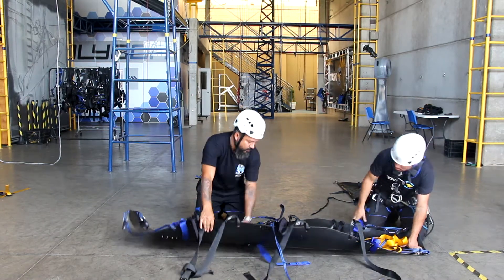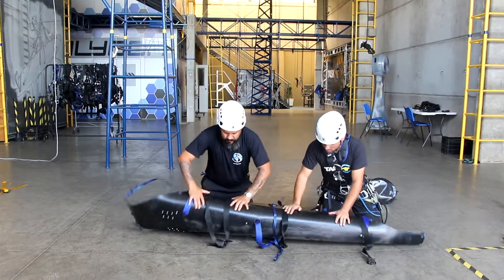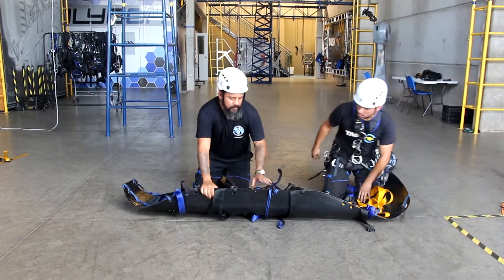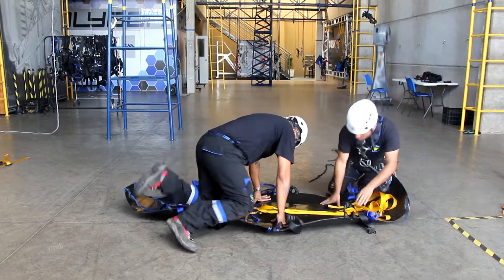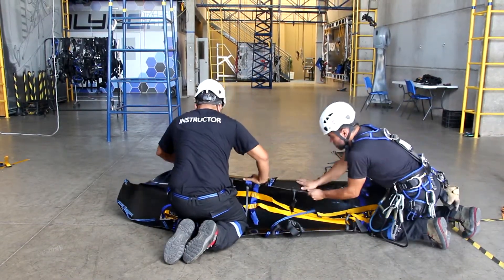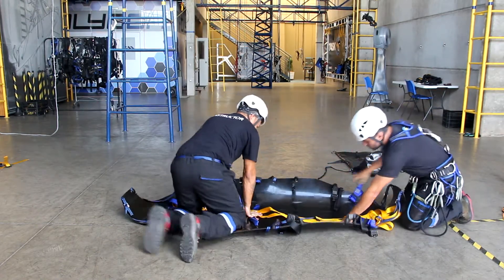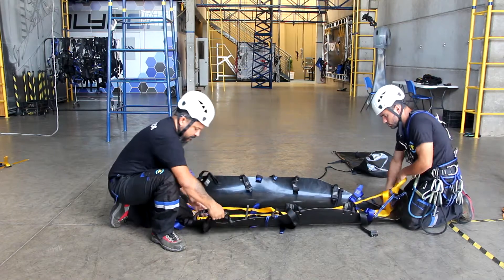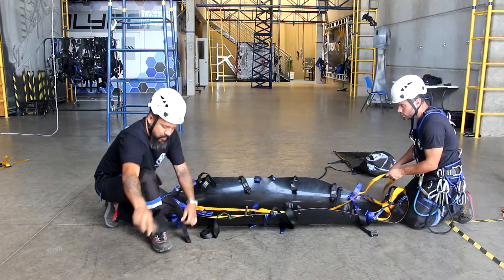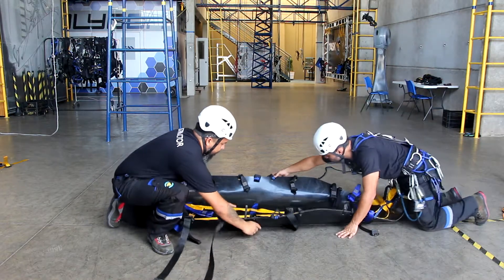We recommend to lightly turn the sheet laterally on both sides of the stretcher. Finally, set apart and organize all the straps before putting the victim inside the stretcher.